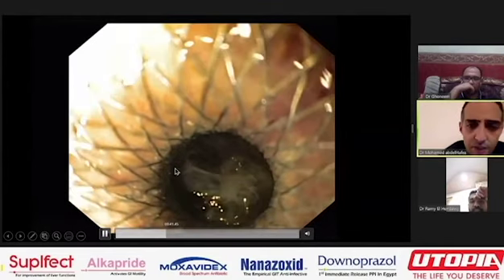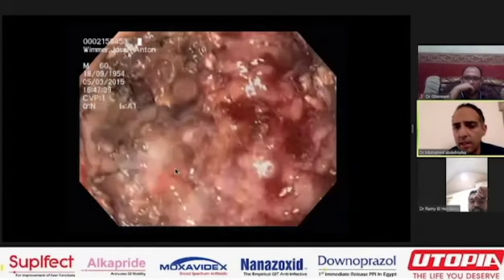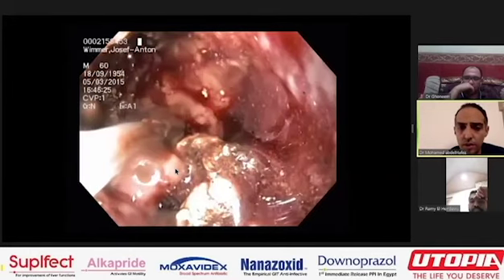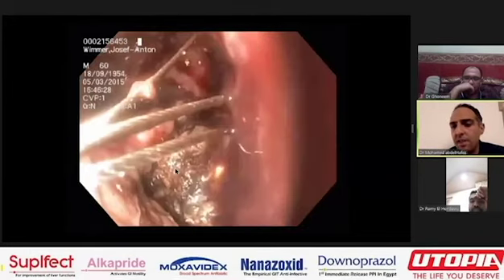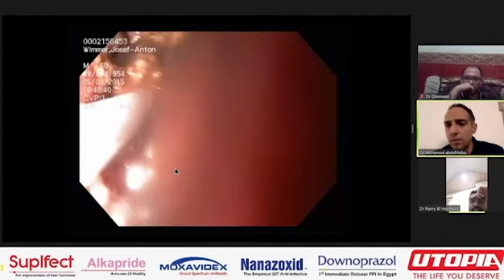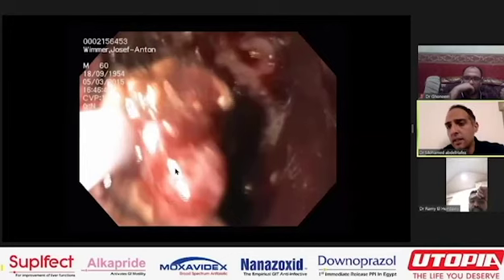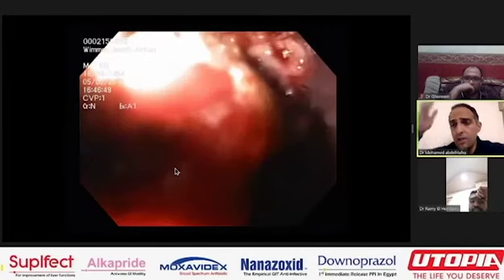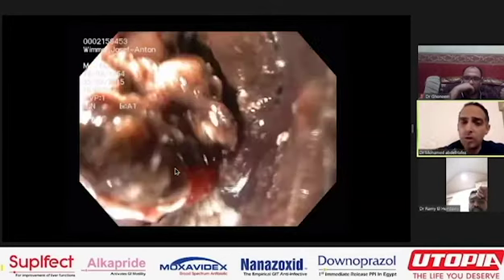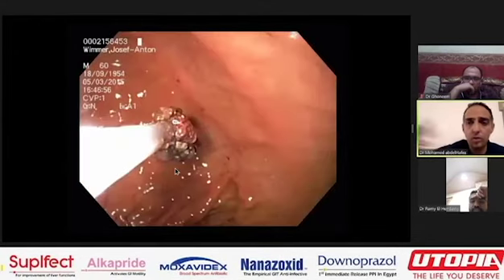What is the advantage of this stent? This stent, at least here in Germany, it costs 4,000 euros. I think like something like 80,000 Egyptian pounds. What is the advantage? The advantage, it is quick, of course, so you don't need to change needle, cystotome, pigtails. And second advantage is it has diameters between 10 till 20 millimeters. So you can come inside and outside. It works like an open valve the whole time for you to come inside and outside the cavity.